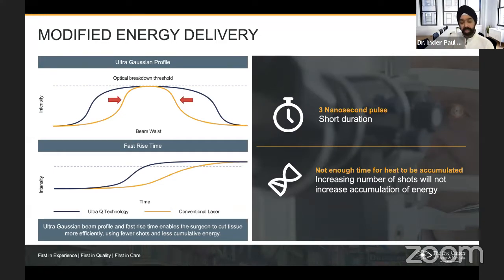We think it's either because of the gas bubbles, but also the particles that can float around into the anterior chamber and block the TM. So I limit the number of shots, not because of retina function, but because of IOP spikes. Around 400 or 500 shots is where I stop now, just to be safe because of IOP spikes rather than retina functionality. So far we're not seeing that upper limit, but me personally, I stop around 500 or so shots on average.